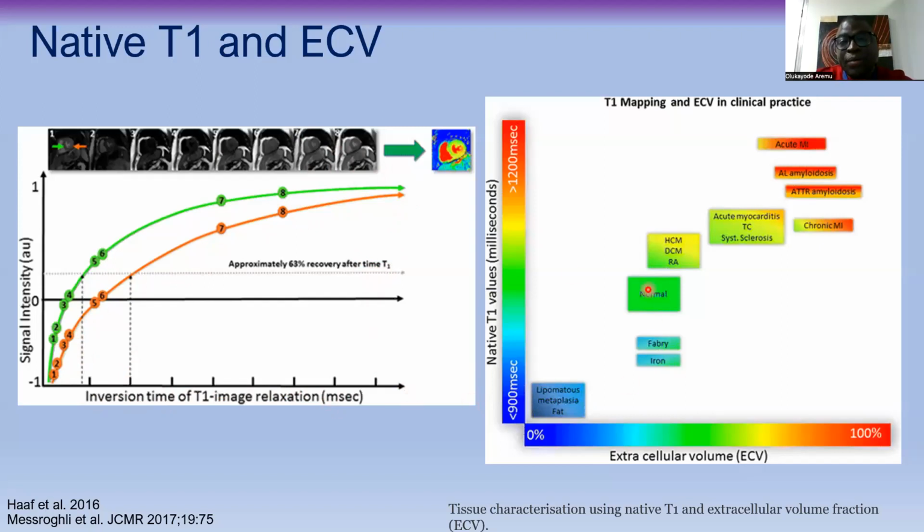And we see the different T1 mapping here, T1 on the y-axis and ECV on the horizontal axis.